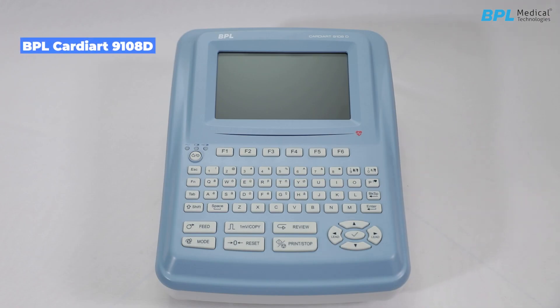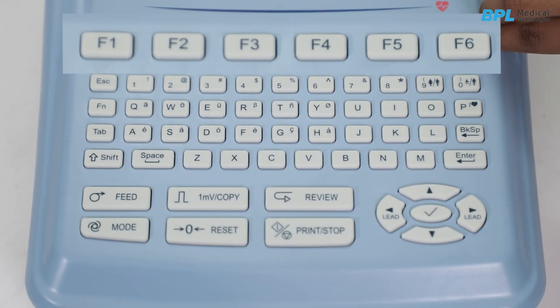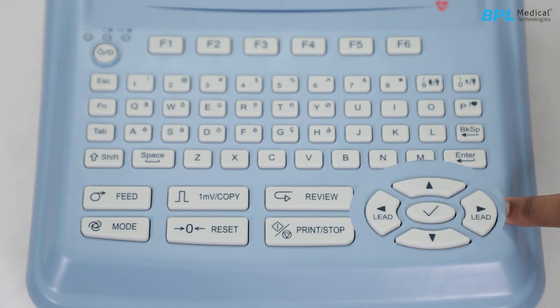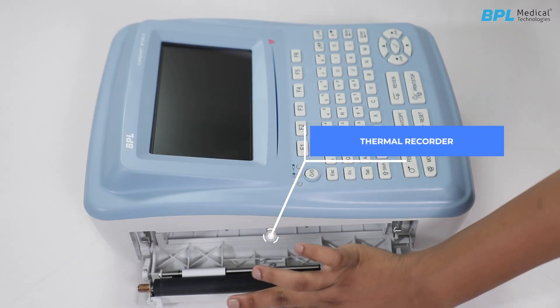BPL Cardiac 9108D is a 12-channel ECG machine with a 7-inch high-resolution display and Glasgow ECG interpretation algorithm. At the top, there is a power on/off button, functional keys to select the menu functions on the screen, a QWERTY alphanumeric keyboard, shortcut keys, and navigation keys. At the left panel is the thermal recorder, which uses folded thermal paper.